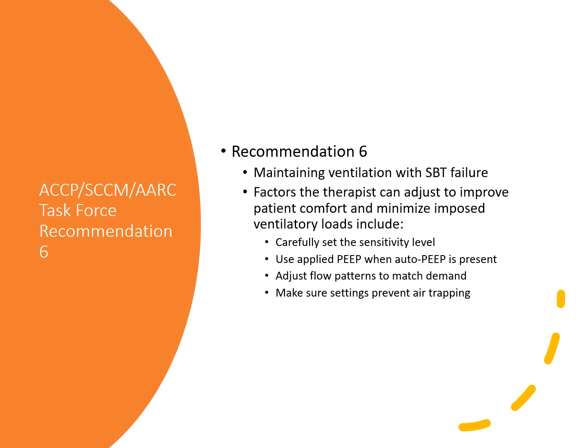Some things that you can adjust to improve comfort include the sensitivity level when you're weaning, right? The patient triggering, adjusting the flow patterns when they're on the ventilator as well, to make sure their work of breathing on assisted ventilation is minimal. Make sure you're preventing auto-PEEP if there is auto-PEEP. Make sure you facilitate the appropriate triggering there and possibly reverse it if you can.